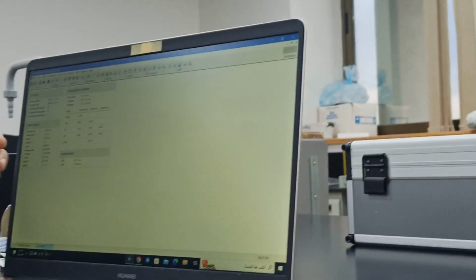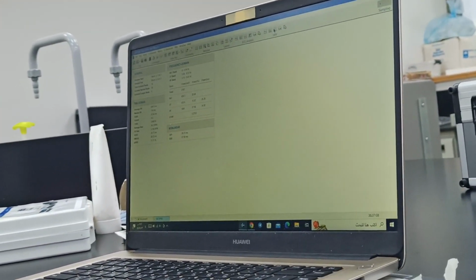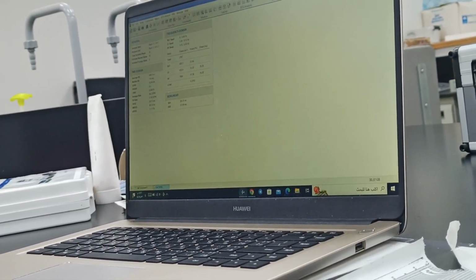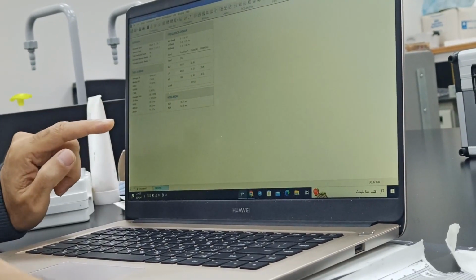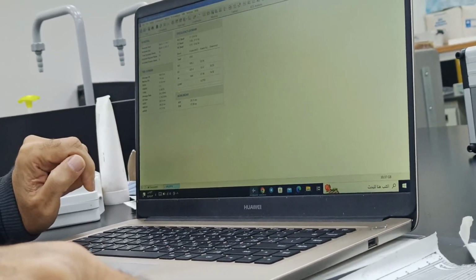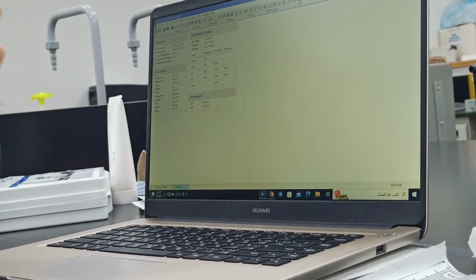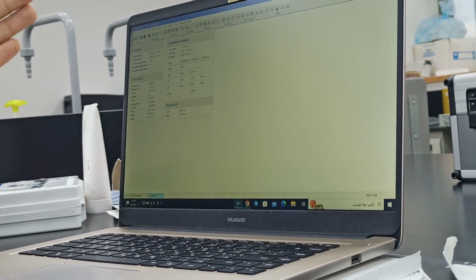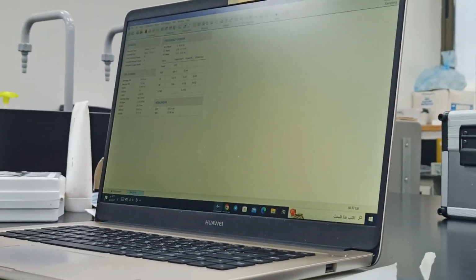What was the factor? We have just reduced the number of beats included in the calculation. Yes, but the one that changed from 32 to 28, RMSSD, is the root of mean of square of successive RR intervals. And the other is the standard deviation. Okay. So I just wanted to show you that if you do not include a large portion for calculation, your calculations are not valid.